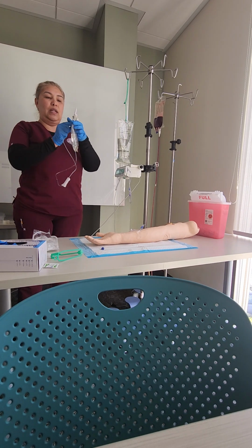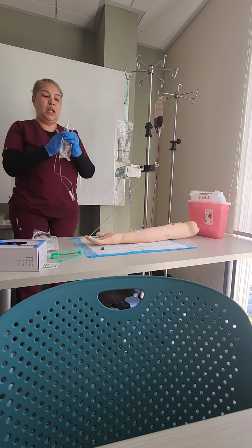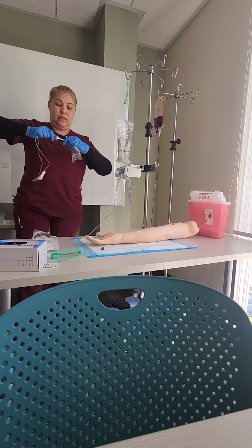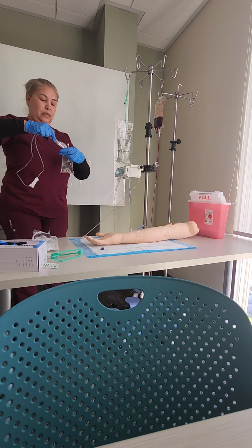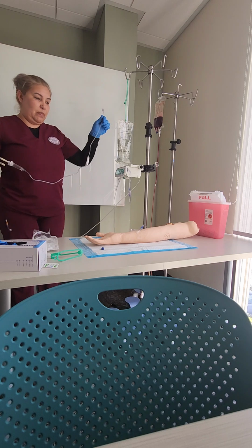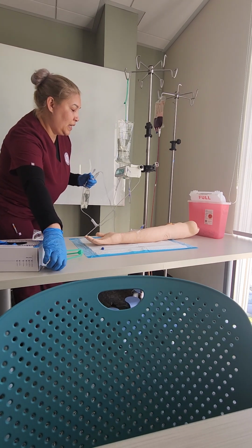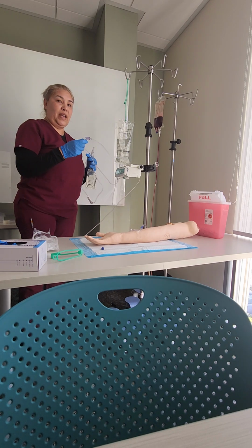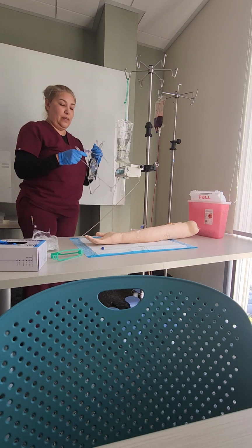I want to maintain sterility. I want to open it up, and I want to make sure I wiggle it in without touching it. Sometimes you have to use a little bit of force. Now, what I want to do is prime this bag, but first I'm going to connect it to my first Y that is closer to the bag that was already going.